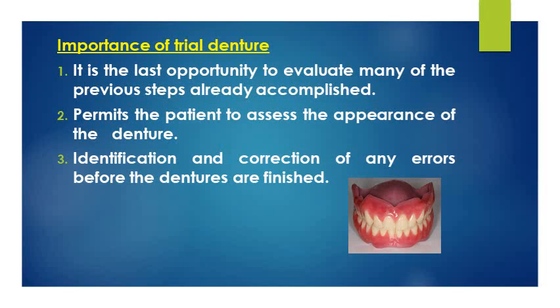It permits the patient to assess the appearance of the denture, and also it gives the opportunity to identify and correct any error before the denture is finished. So it is a very important step. It is the final and last step before fabrication of the final complete denture.